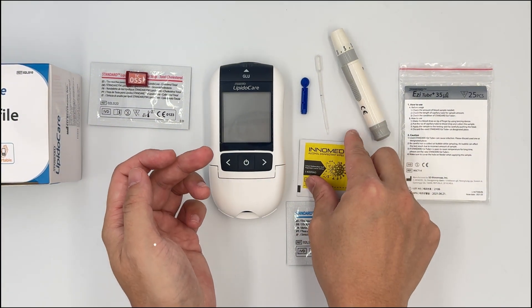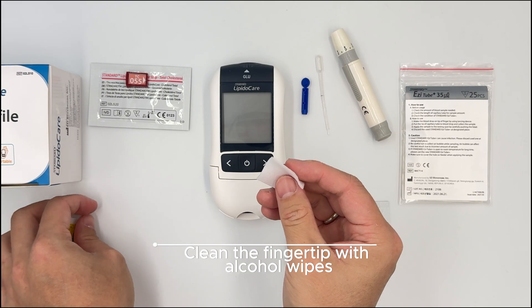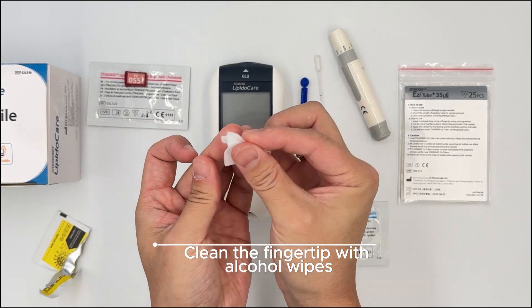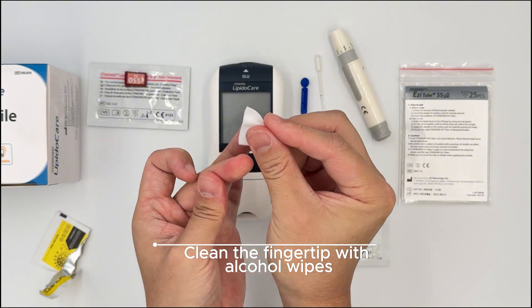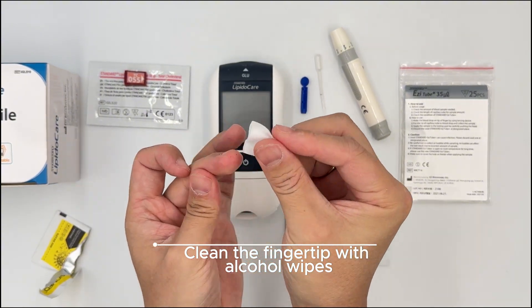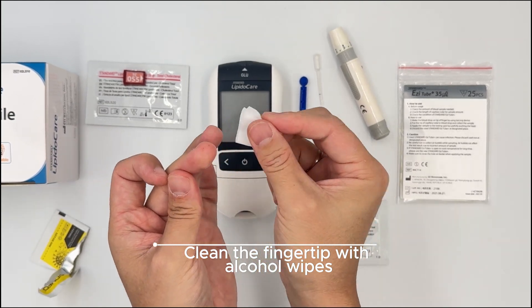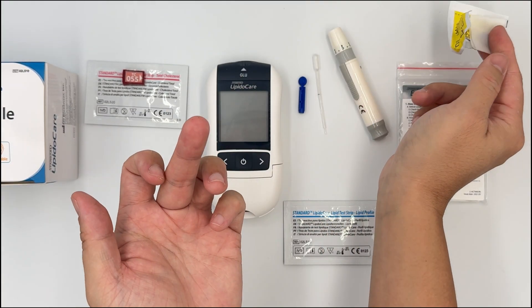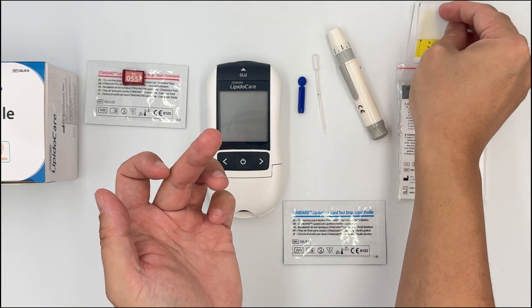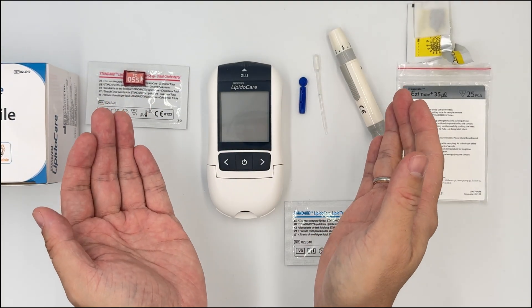First thing first, make sure you clean the finger of the patient. Clean it very thoroughly because sometimes there will be oil or dirt on the finger. When you do it as the first step, you can let the alcohol on the skin dry off while you prepare the other things.